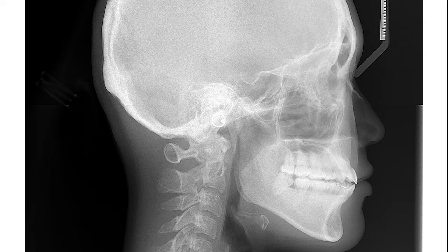The lateral cephalometric radiograph may be conventionally taken with the patient's right side or left side located nearest the film, depending on the country. The posterior anterior cephalometric radiograph is taken with the patient facing the film.